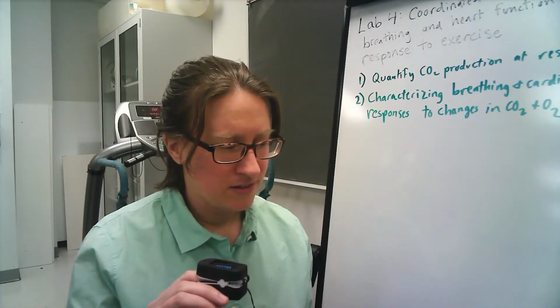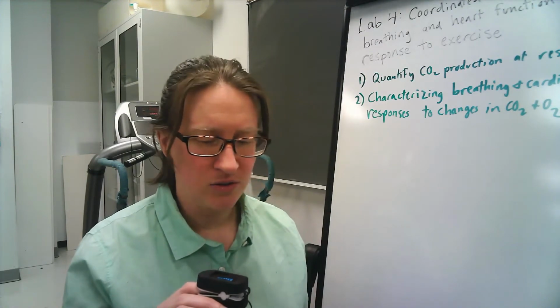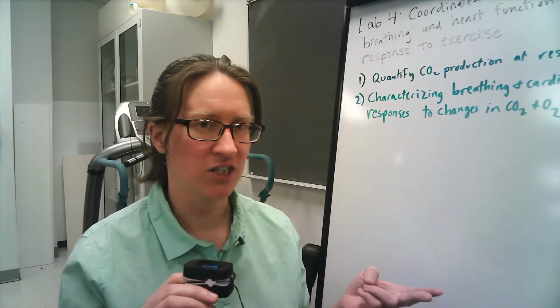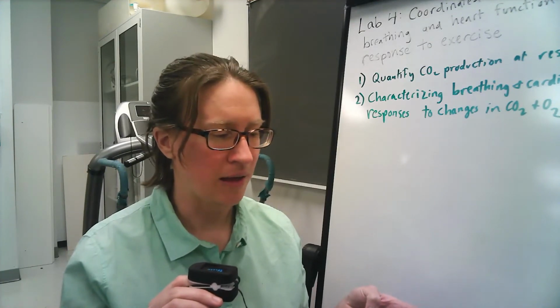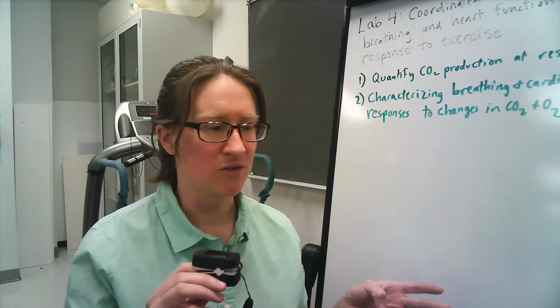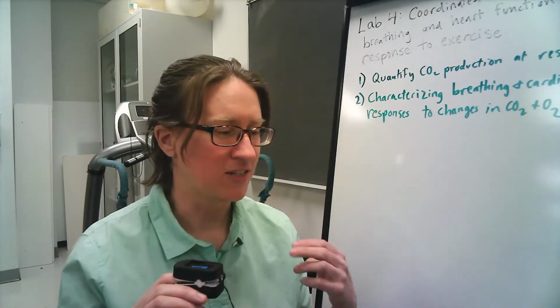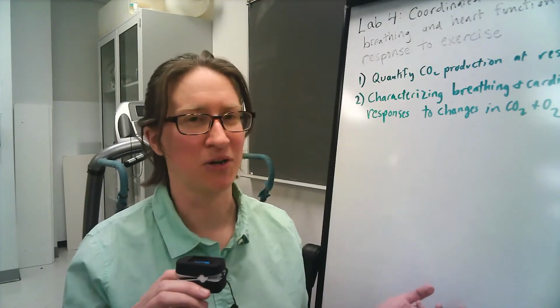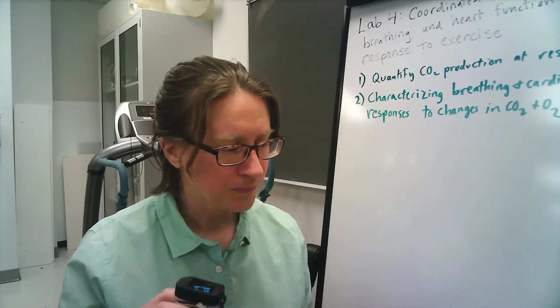So for this, you'd start out measuring your heart rate, your blood oxygenation level, and then also at rest, or at baseline, how many breaths you typically take per minute. And you could do this just by counting breathing rate over a 30-second time period, then multiplying by 2.